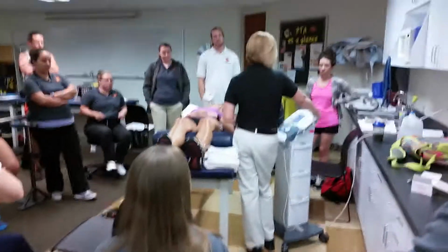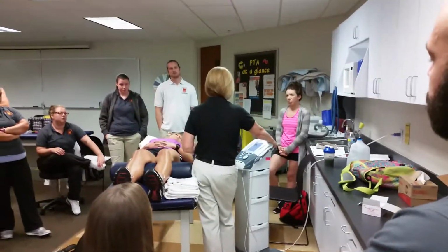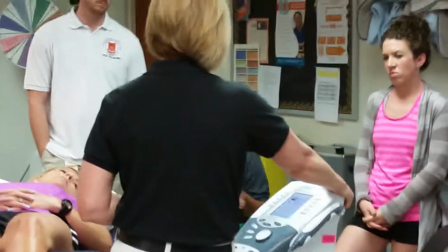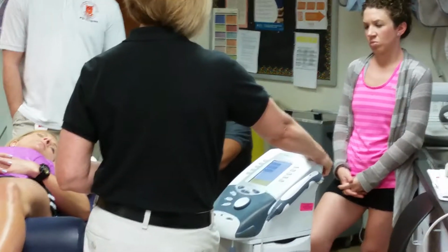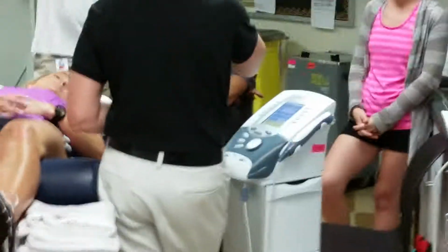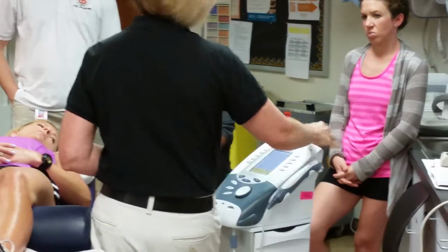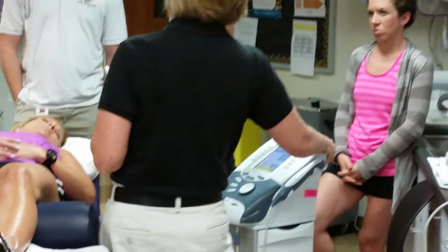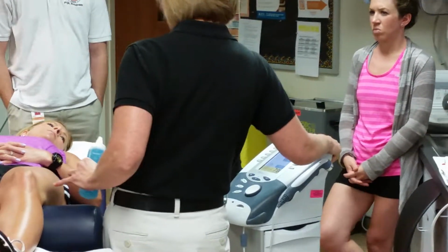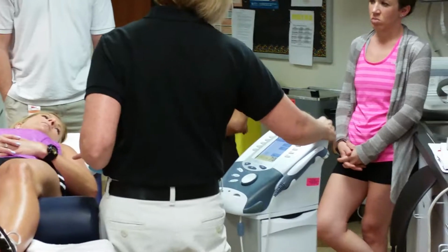And she's subacute, so I want a thermal effect. If she was acute, I'd want non-thermal effect. Takes a second. So try not to turn it off when you're in practice, because you'll freak out because it takes a second. All right, so again, billable is 8 minutes, right? Plus, I have a good enough treatment area. I want to get a good treatment in here, so 8 minutes is a good time frame.